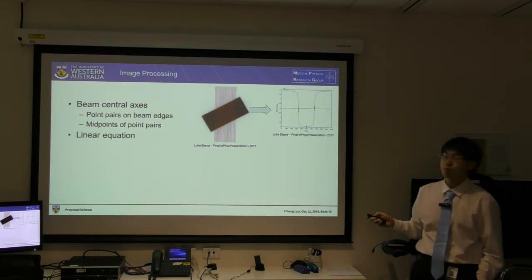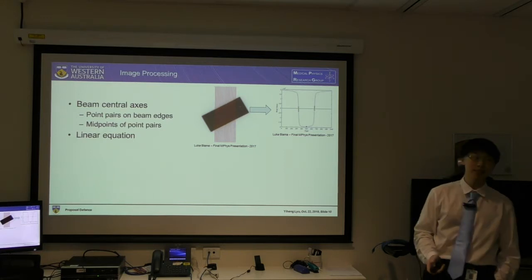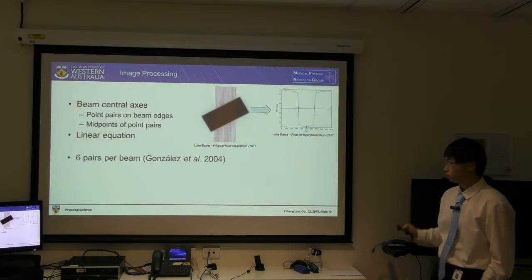By using all the midpoints on one beam, we can fit a linear equation, and this linear equation will represent this beam on the image.